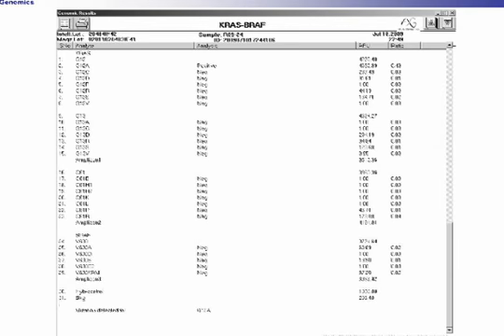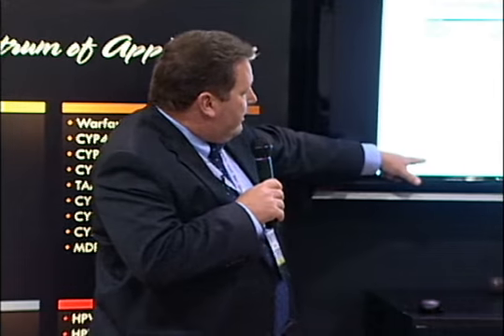This is an example of the readout that you see on the Infinity. We have 3 different amplicons, one for codon 12 and 13, one for Q61, and one for BRAF. And what the software will do is, based on the amount of signal that's detected, it will give you a positive or negative indicator for the presence or absence of a mutation. And then at the bottom, it's summarized: mutation detected for G12A in this case.